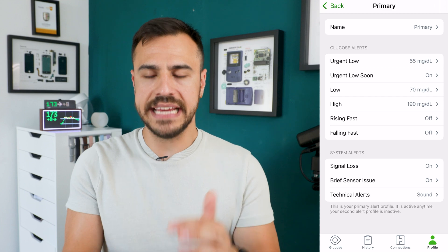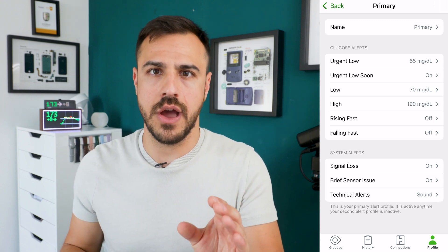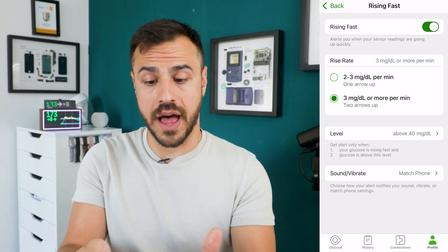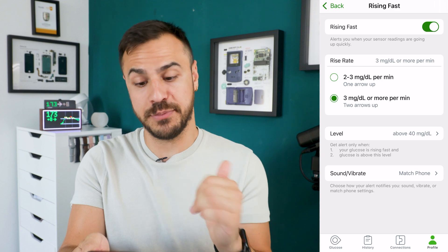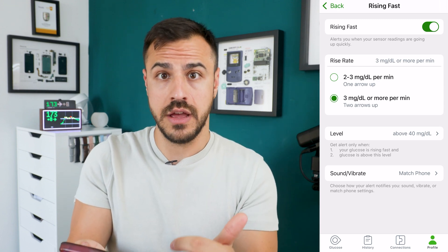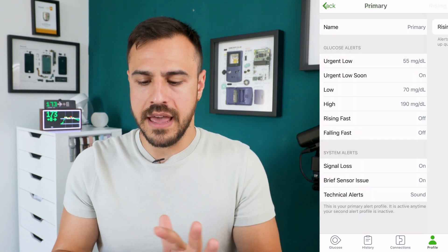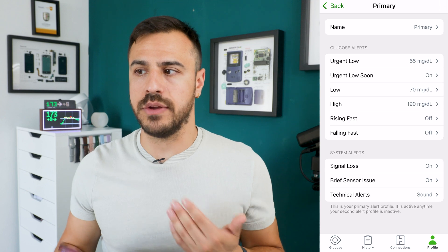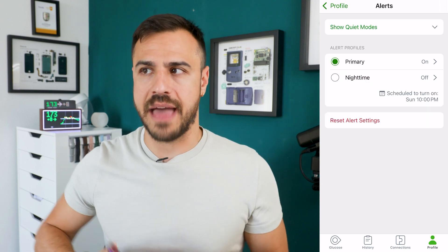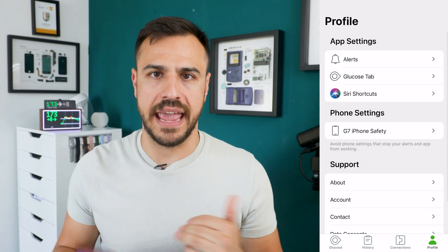The last thing I want to show on the alerts page is the ability to set a rising or falling alert — I have these turned off and haven't found the need for them. For rising fast, there are a couple of options: two to three milligrams per deciliter per minute, or three milligrams per deciliter per minute with two arrows. When glucose is rising that quickly above a set level, you'll get an alert. For me personally, it's very rare that I have a double arrow, and I don't rage bolus, so I don't have those on.